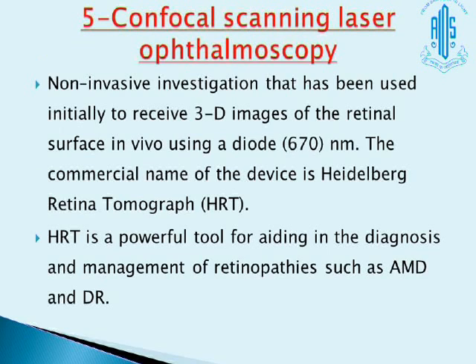We have had this modality in our faculty for 10 years, and it is very effective. It is a non-invasive investigation that was initially used to obtain three-dimensional images of the retinal surface in vivo using a 670 nanometer diode.